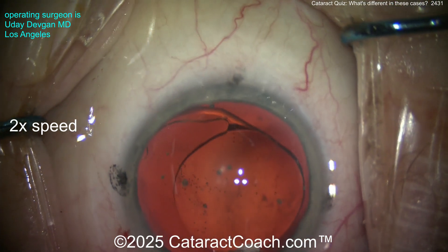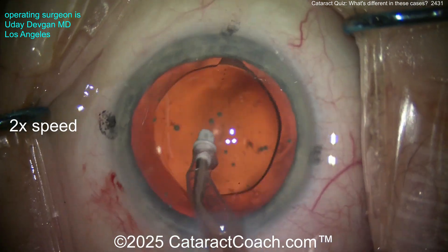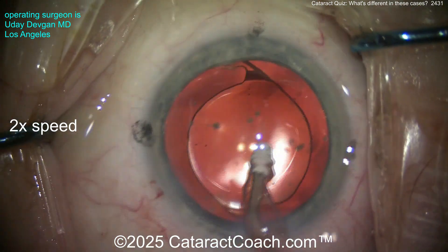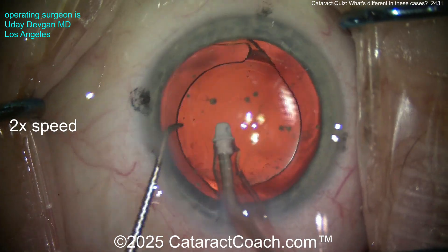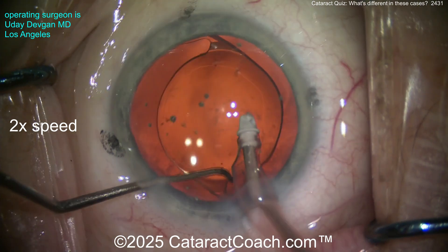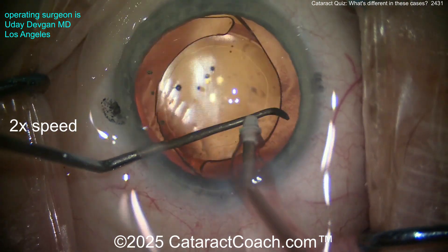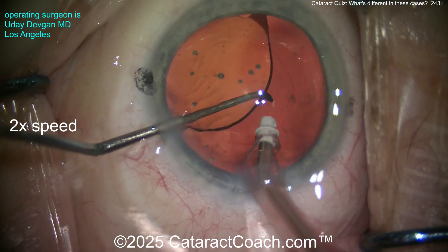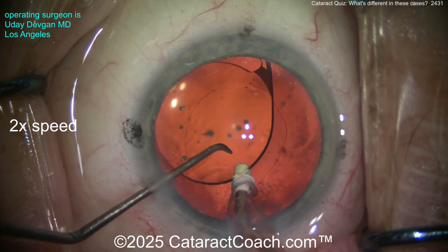There was hidden subincisional cortex that, if you didn't look carefully, you may not have noticed. But on post-op day one you'll notice it, because it swells up and hydrates overnight and becomes this big blurry thing in the patient's vision the very next morning. The trick on this case was that there was hidden cortex in the subincisional space. Now going behind the optic to remove viscoelastic.